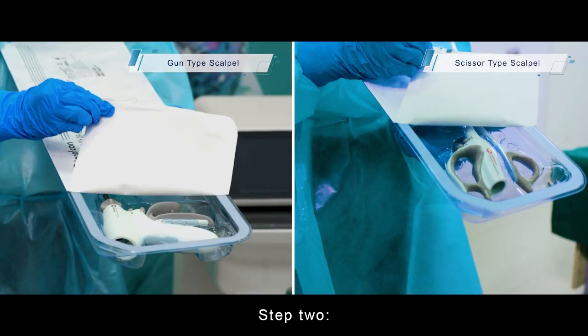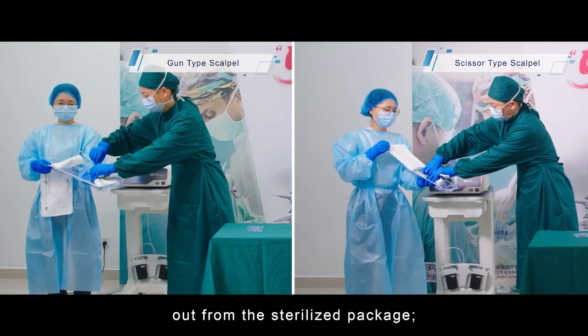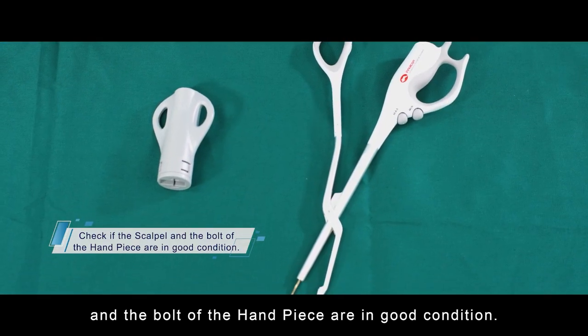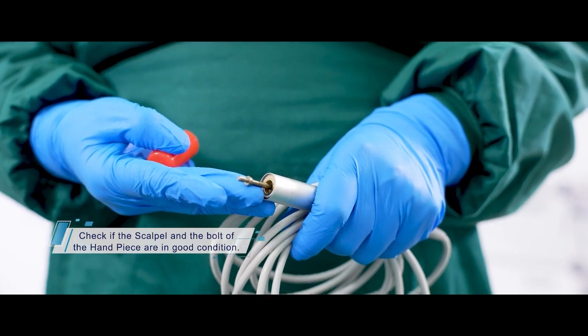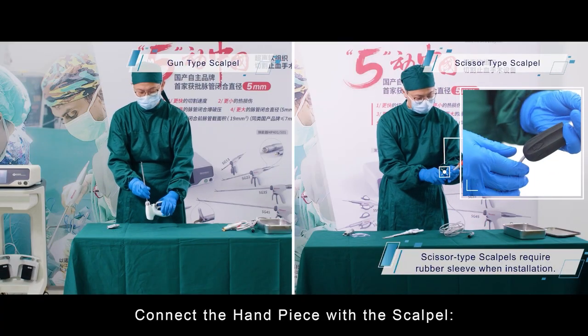Step 2. Take the scalpel and torque wrench out from the sterilized package. Check if the scalpel and the bolt of the handpiece are in good condition. Step 3. Connect the handpiece with the scalpel.